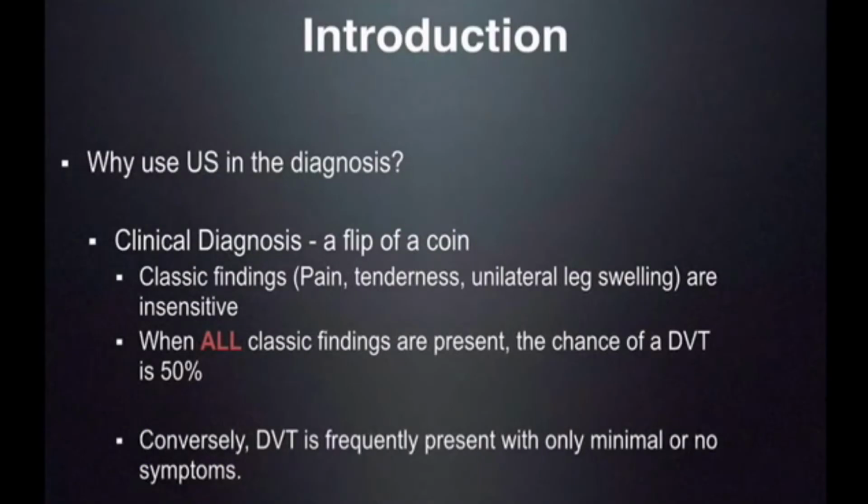So why use ultrasound in the diagnosis of DVT? Well, clinical diagnosis is practically a flip of a coin as to whether a patient has a DVT or not. The classic findings, which were taught in medical school as pain, tenderness, and unilateral leg swelling, are all very insensitive. When all of these findings are present, the chance of having a DVT is 50% or less. The flip side is also true, in that patients that do have a DVT frequently have only one or maybe none of the classic findings present.